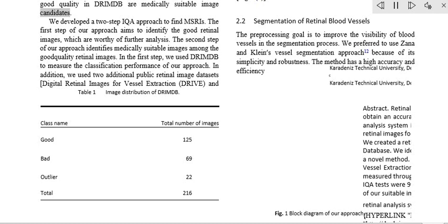Therefore, we were able to reduce our OD search area from the entire retinal image to a neighborhood of 2 OD diameters of the maximum value index. In other words, the horizontal center of the OD should remain within [minx, maxx], where minx equals argmax VH(J) minus 2 times R_OD, and maxx equals argmax VH(J) plus 2 times R_OD, Fig 3b.